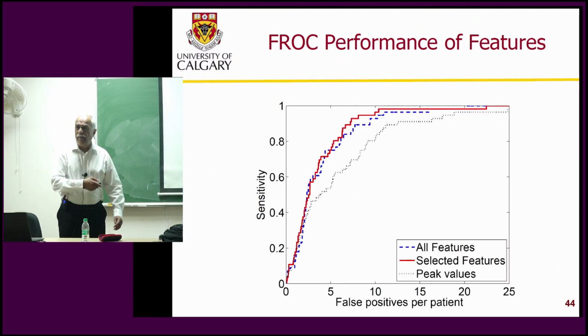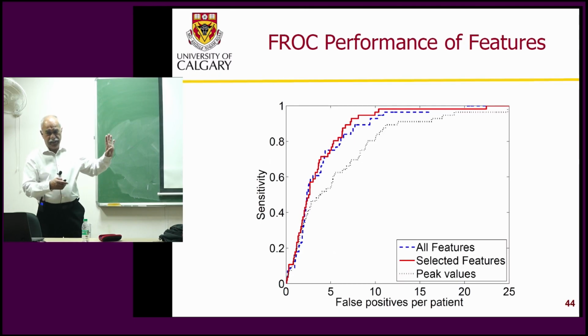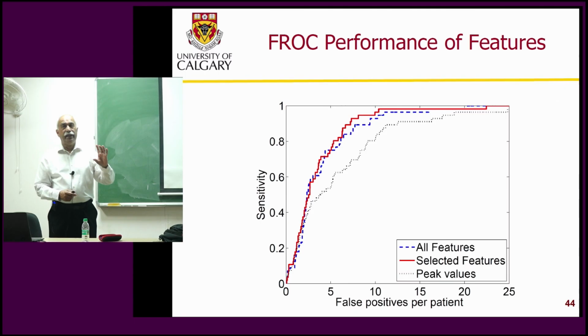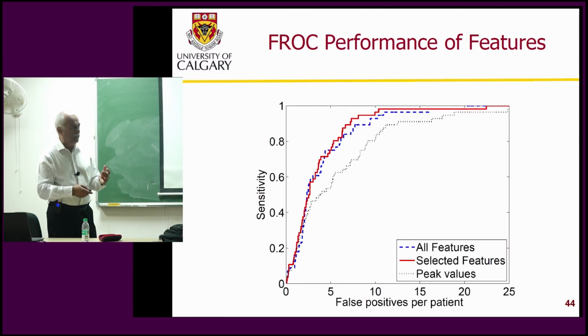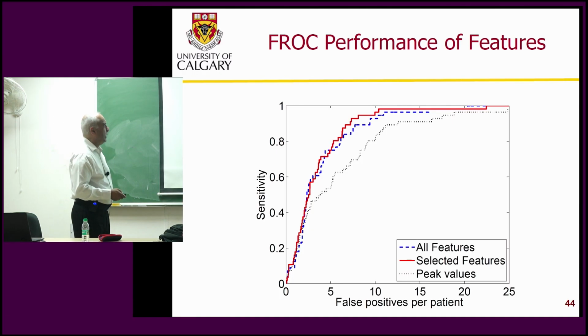So like this, we defined a few more features. The basic idea is to characterize spicules in that window using magnitude and angle response detected by our methods. So we put all of these features. In the end, we got some 84 features, I think. Something will come up later.